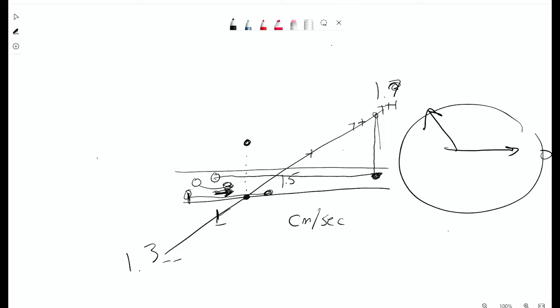So this one right here is only going to go a very small distance, so it's only experienced a very small change in the magnetic field strength. So it's only slightly ahead of the one that was holding still. Whereas this one's somewhere in between.